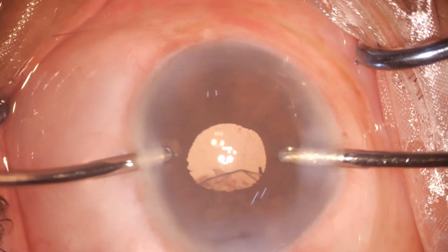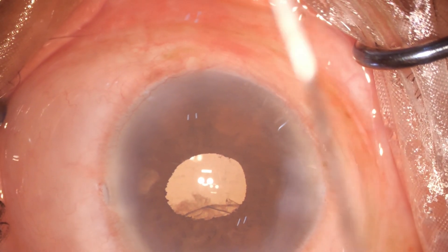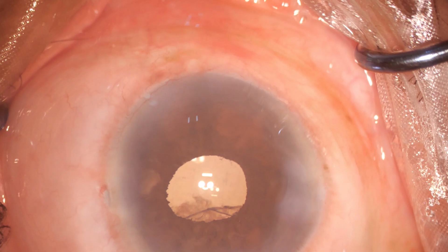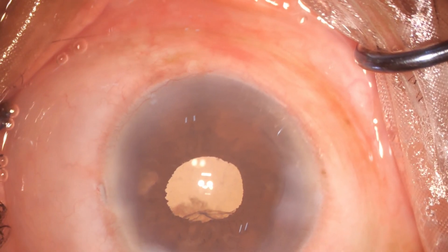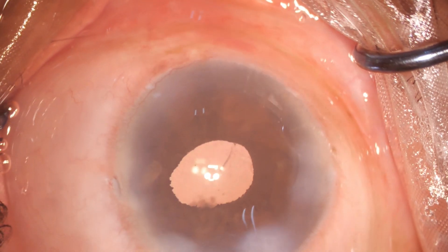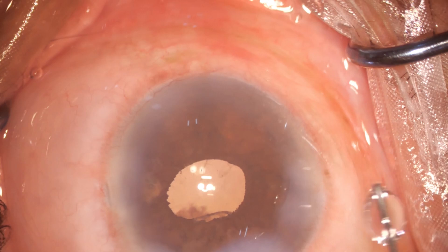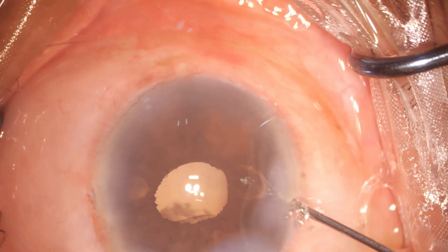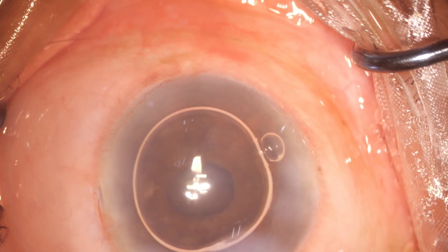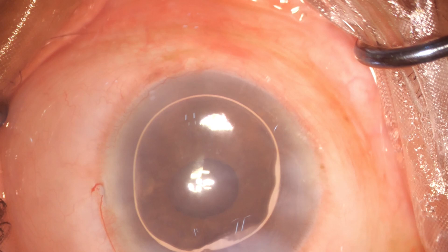You can see the bag at 6 o'clock; however, there is luckily no vitreous. By just doing a simple hydration and leaving an air bubble to deepen the chamber — not attempting to remove any other tags — closing the eye and removing the vitrectomy port. That is the end of the surgery.